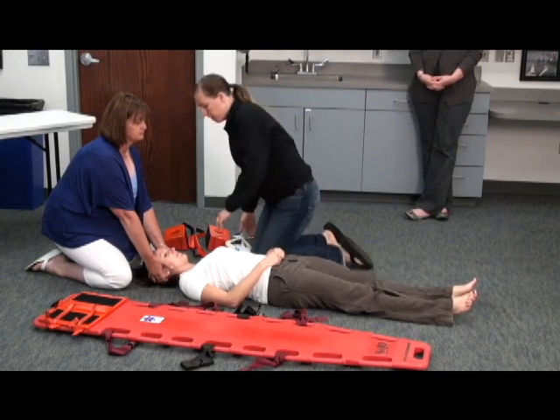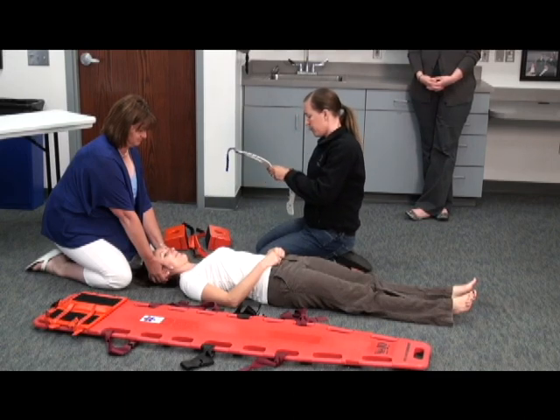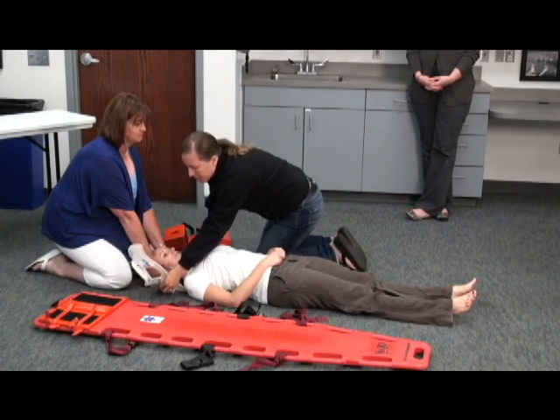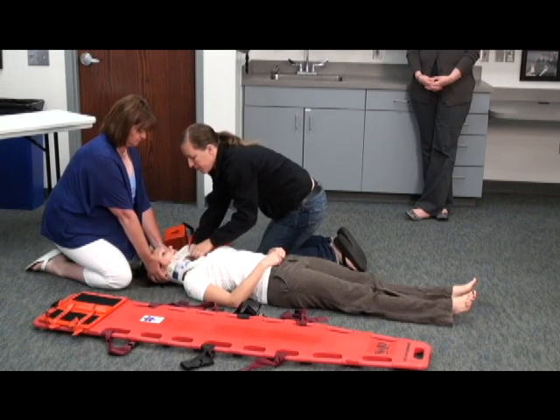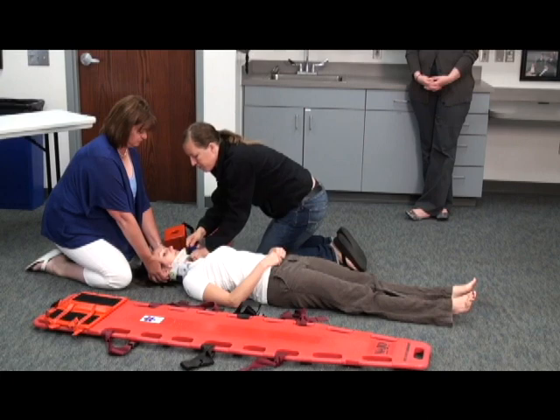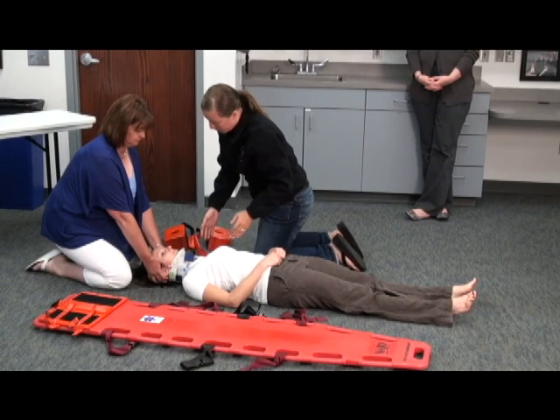Right now I'm going to measure for a C-collar. And how's that feel? Can you still breathe? Yes.